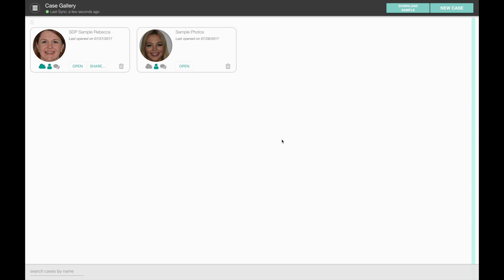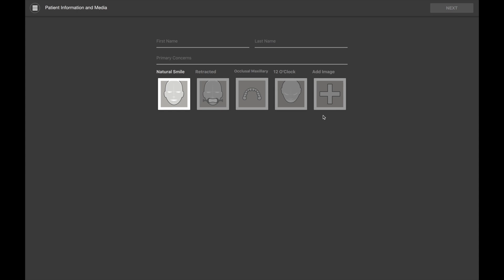When you log into the app the first thing you see is your case gallery. At first it'll be empty and you can start learning by downloading a sample case, or if you're ready with your own patient you can dive right in and start a new case. There are other details about the case gallery and cloud functions that we'll cover in a separate video. For now we're going to dive right in and click on the new case button.